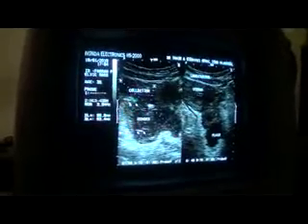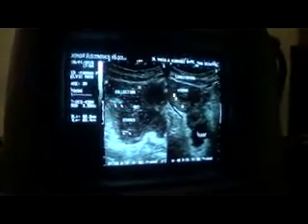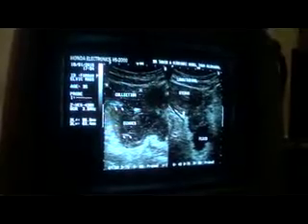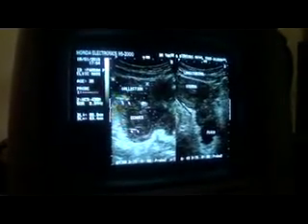This is the uterus, the fundus of the uterus that you are seeing, the anterior wall and the posterior wall. This is the longitudinal section. Post manipulation, it's not unusual to see the uterus in this shape. Note that the fundus is intact, the anterior myometrium is intact, and the outer surface of the anterior wall is intact. So far as the posterior myometrium and its outer surface are concerned, up to the upper half we can see it intact, but in the lower half we see a breach.